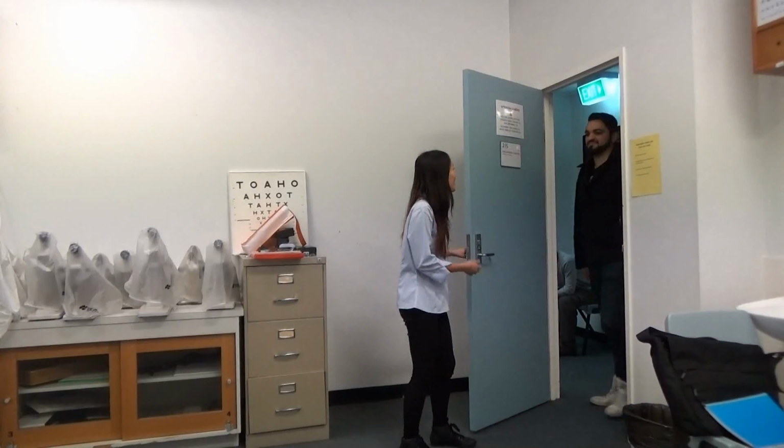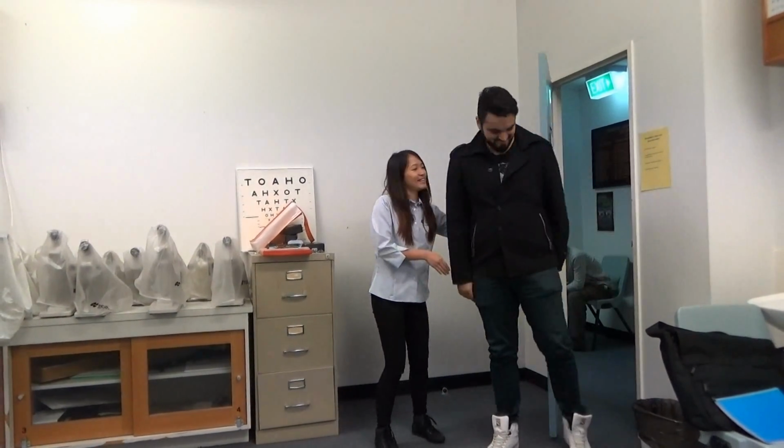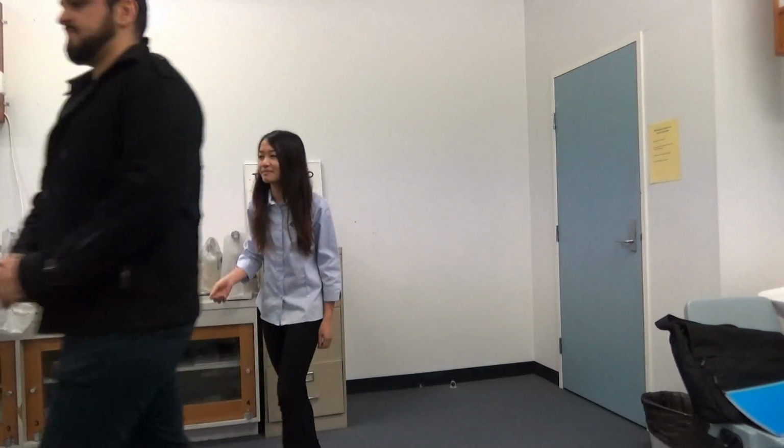Hi, my name is Hong. I'm your orthoptist today. Nice to meet you. I'm Matt. Today I'll be conducting an eye examination on you to test if you have single or double vision. So just please take a seat right there.